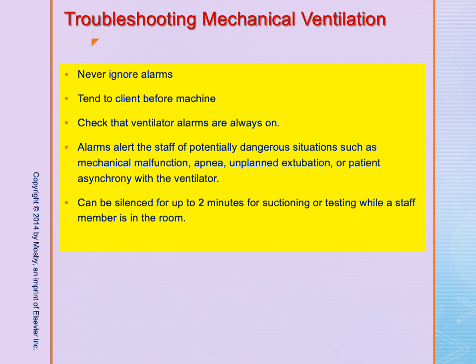You want to just remember that alarms are there to alert the staff and let them know that the patient is experiencing a potentially dangerous situation. So alarms should never be silenced unless you are actually in the room with the patient, and never silence them for more than 2 minutes at a time.